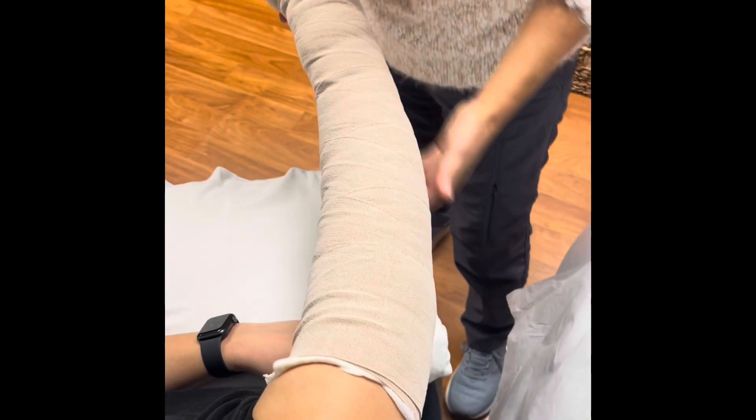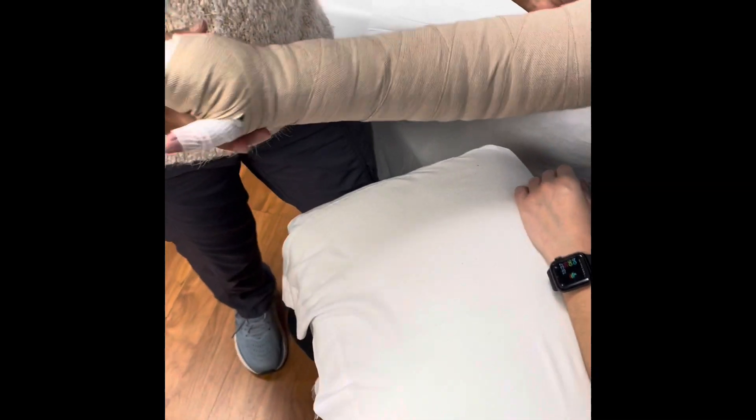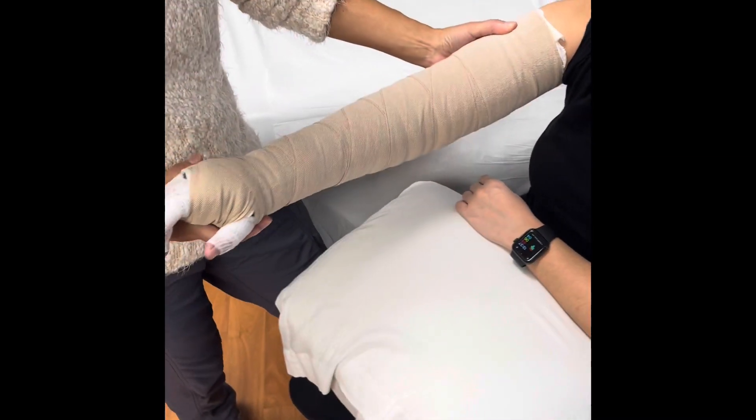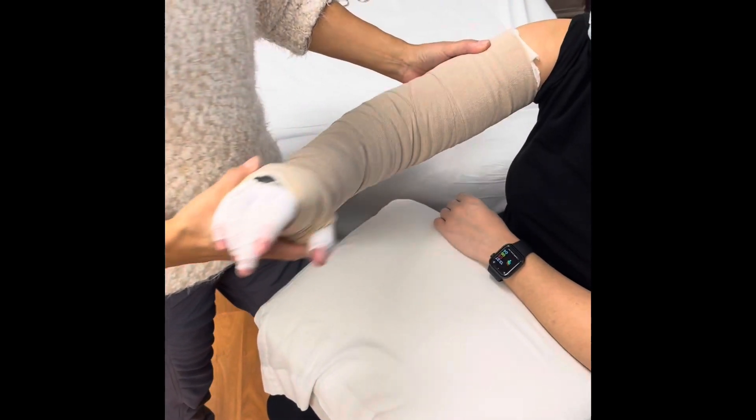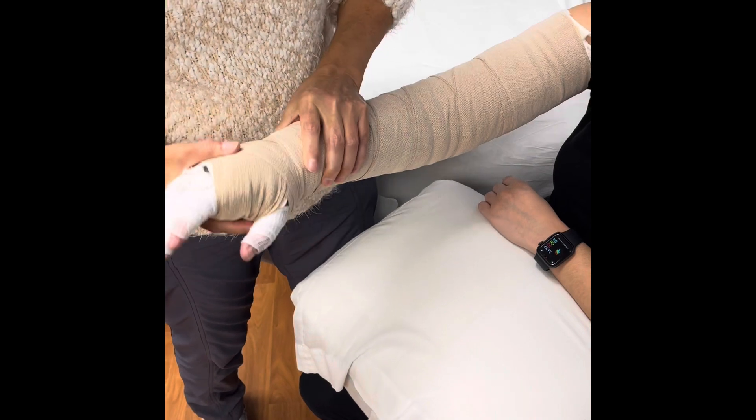Then we check the mobility of the patient — be able to bend the elbow. We encourage the patient to do their exercises while bandaged and to use their arm. At the wrist, same thing — up and down. That's it.